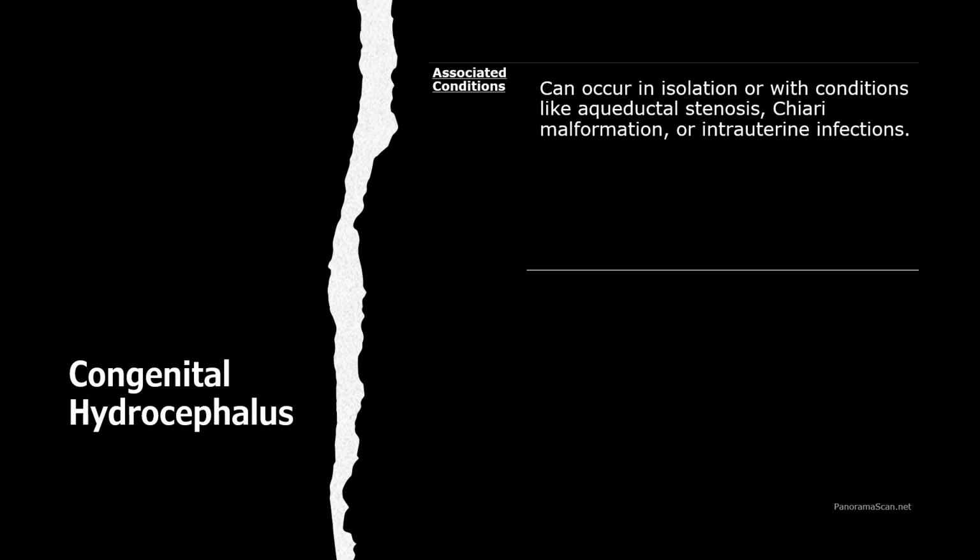Identifying these associated conditions is essential, as they may provide insights into the underlying cause of hydrocephalus and have significant implications for prognosis and treatment.